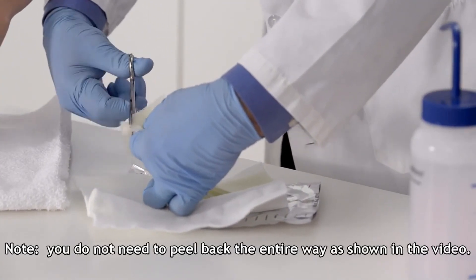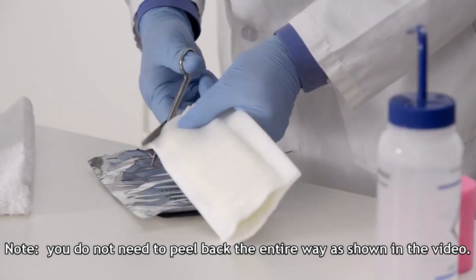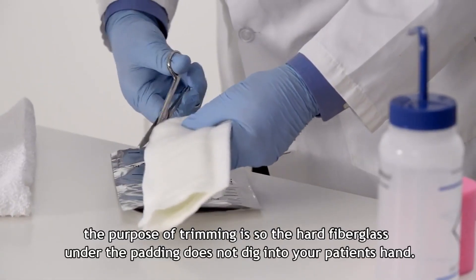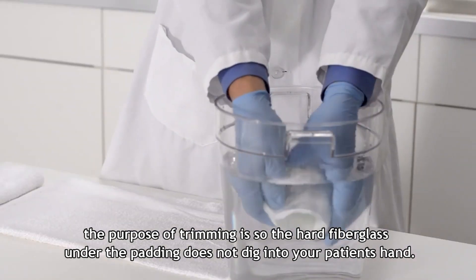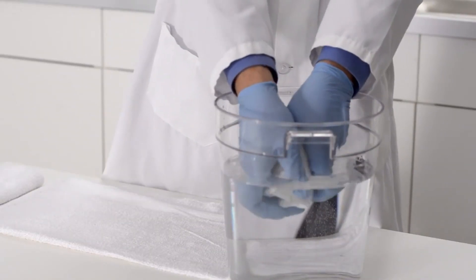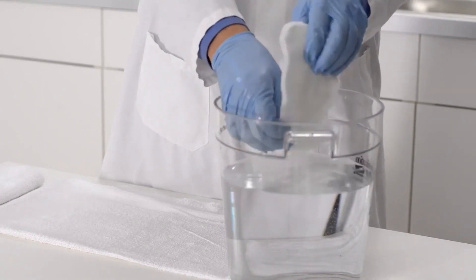Remember to wear examination gloves during direct contact with uncured resin of knit fiberglass. Next, you need to wet the splint. To wet the splint, immerse it in a bucket of water and blot off excess water in a towel.